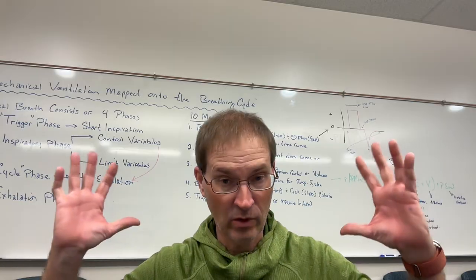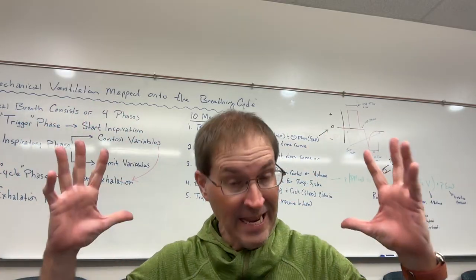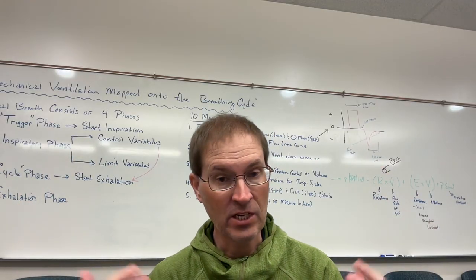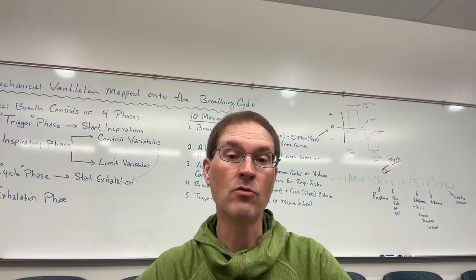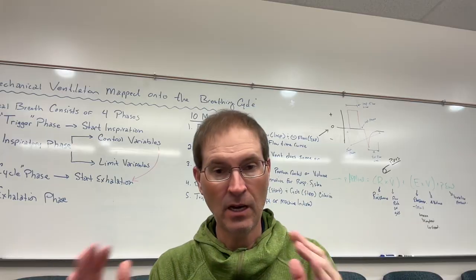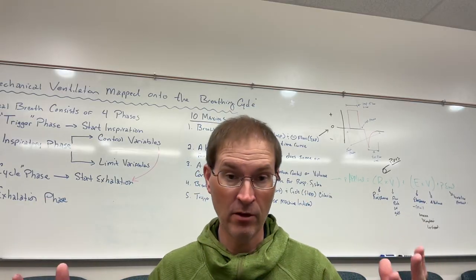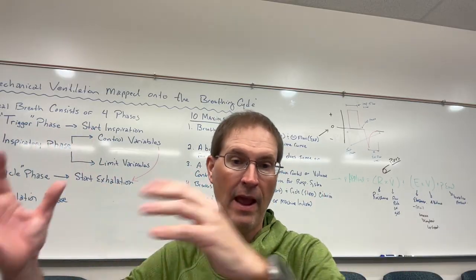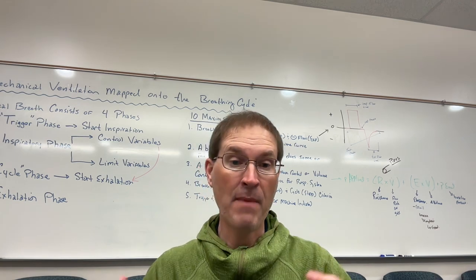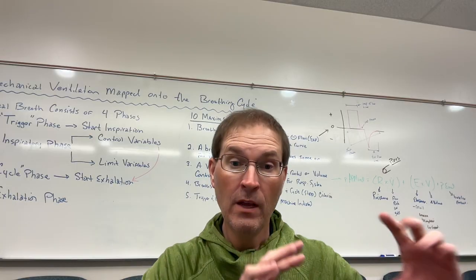And then, once we understand the universal terminology, or a set of universal terms, because again, the language is not universal when it comes to individual companies, but starting at a foundation of language that we can all agree on, or that we will for this series of videos, we can then apply that to every individual manufacturer that may have specialized pet or trademark names for the modes.